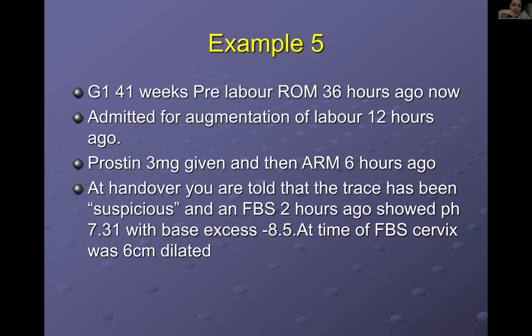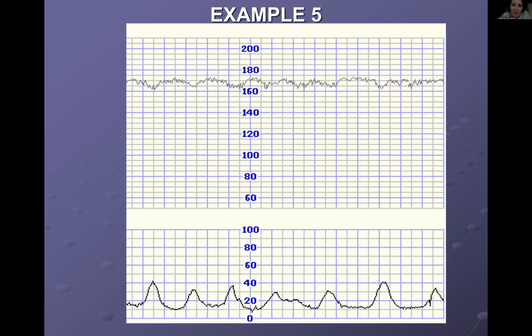Now, already, you might be wondering how come she has still not been delivered. If a prolonged labor, 2 hours ago they did a fetal blood sample, and they didn't follow up on that, and she's still not delivered. Okay, so the CTG is looking like this.